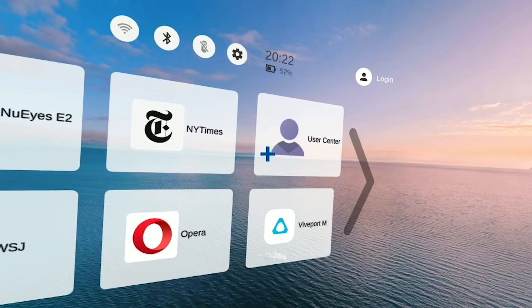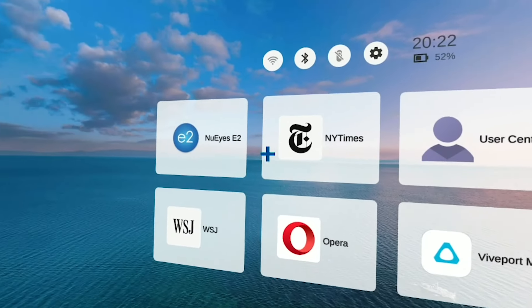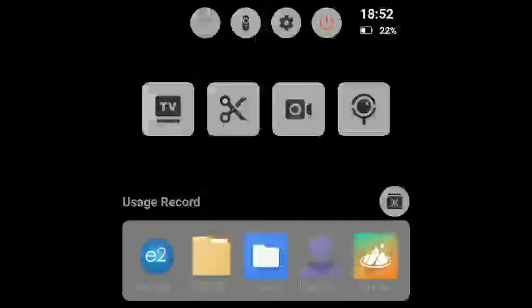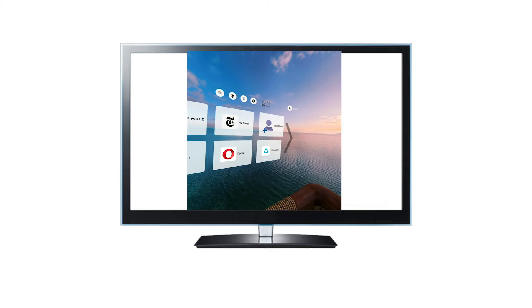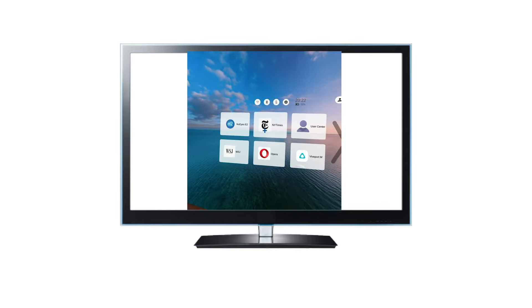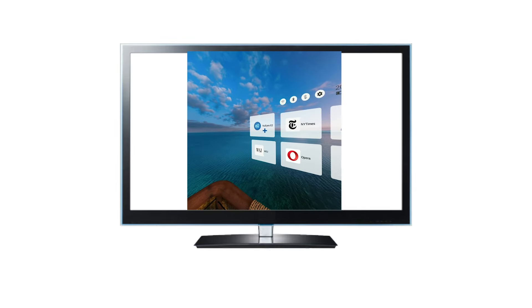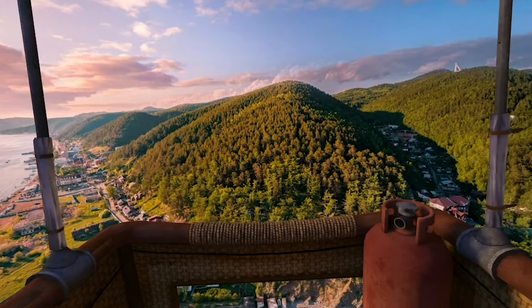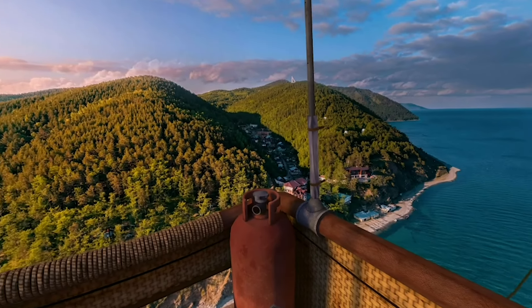As you learn your way around the menu, you'll see different functions to explore, like picture or video mode. This lets you record video and take pictures with your E2 and store them on the glasses. You can also cast your screen to a monitor or computer that's Bluetooth capable, change your scene settings, play virtual reality games, and much more.